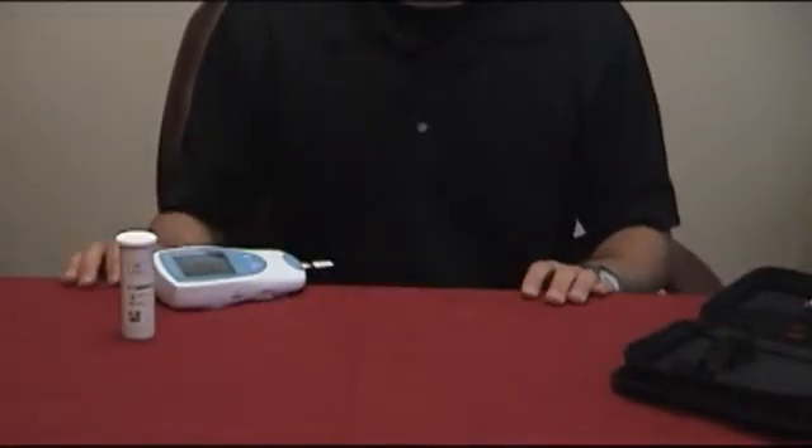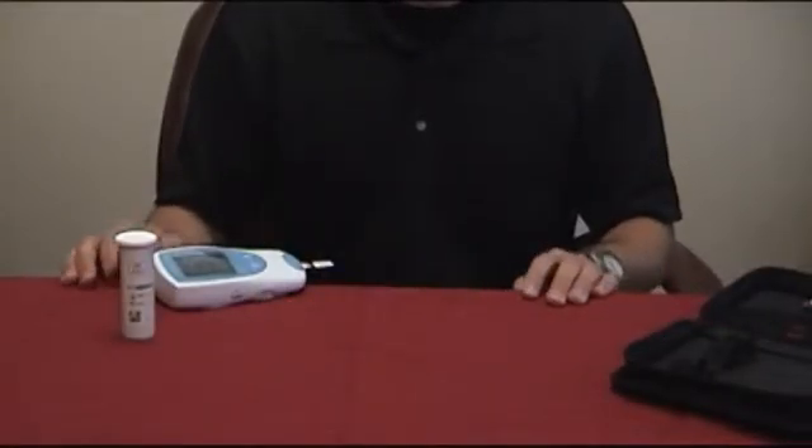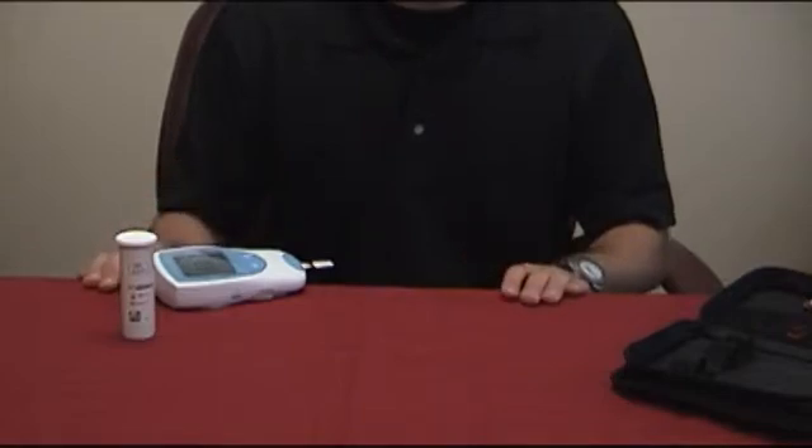The meter will beep and a 180-second countdown will start. During this countdown is the only time you may apply the blood.